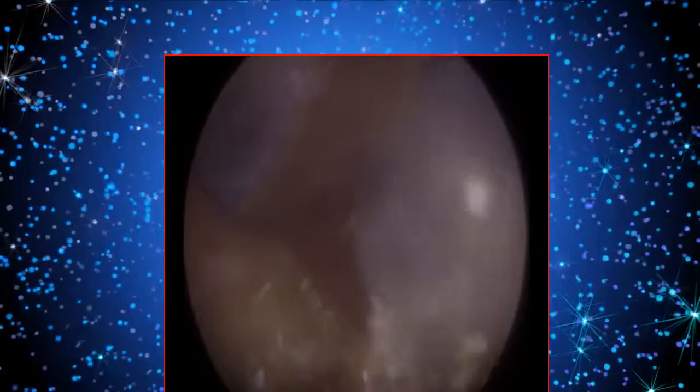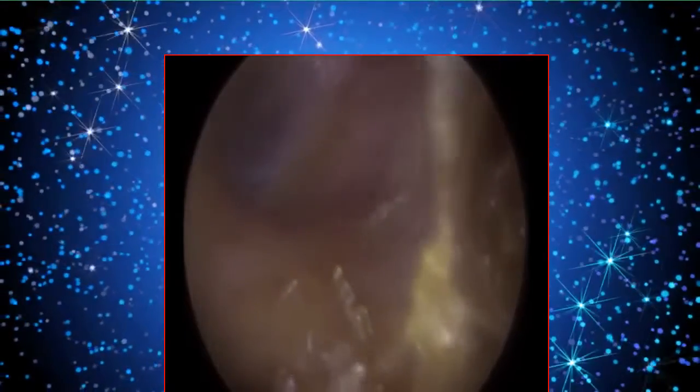So the surface wax isn't really going to cause the client any symptoms, and he was tolerating the procedure very well indeed, so I felt comfortable and safe enough to hover over gently and just lift it and peel it off. A bit of cilia there, at the entrance.